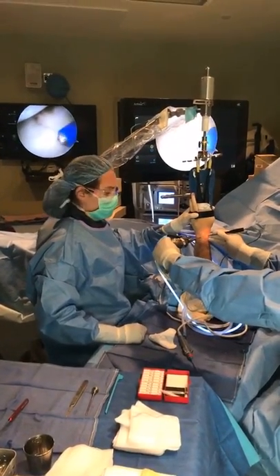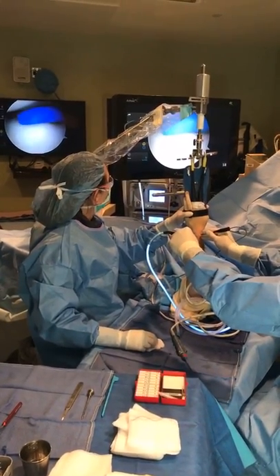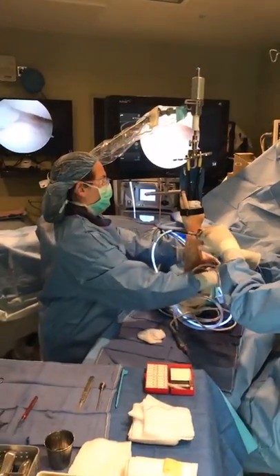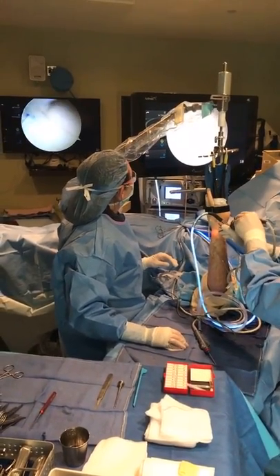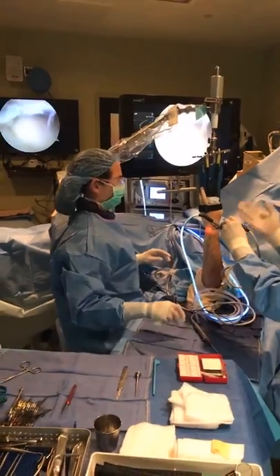Okay, so there we go. Take a look at the TFCC again. Okay, looks very nice. There you go. Tight as a drum. So we're going to keep them in this position.